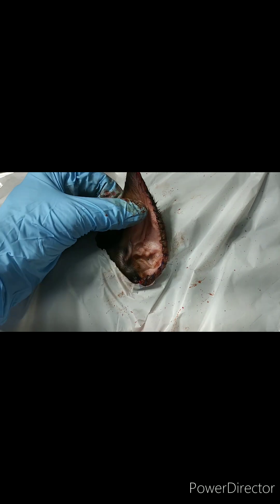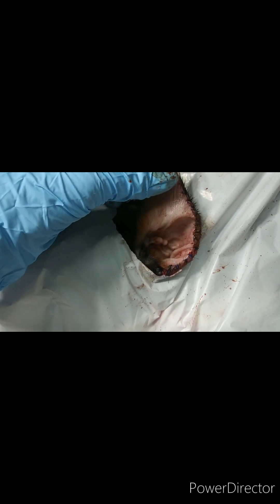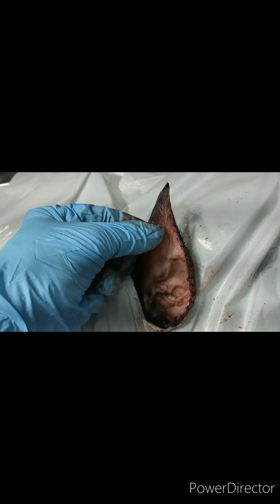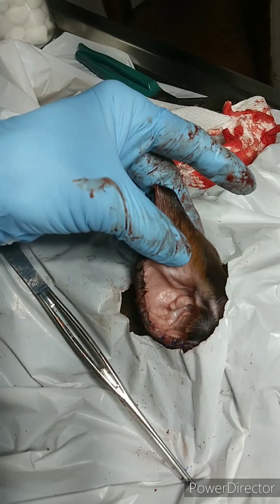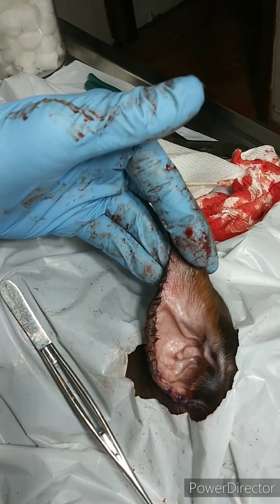The left ear has been trimmed and sutured. I'm going to put a foam splint in this ear in a minute, but I've got to do the right ear first. This is the right ear — fixing to put the stent in.